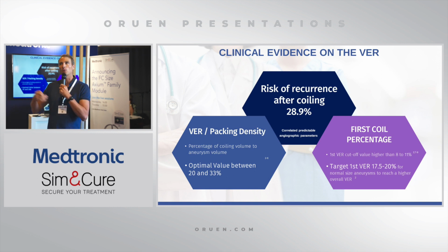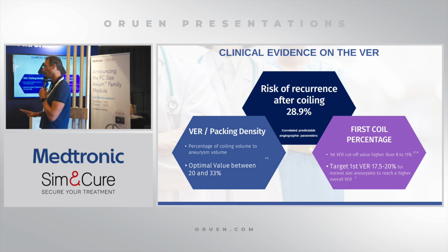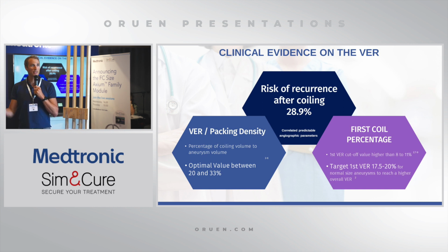And we just think, okay, just fill it. And when you think it's full and you cannot put in the last coil, then you stop. But this is not good, because the complication always occurs with the last coil. And if you do not put it in and there's no complication, this is a waste, like 500 euros in Europe, 1,000 euros in the US. Don't ask me why, but the waste is important. And I think in many angio suites in Europe and the US, people are hesitating to put in this last coil. This last coil may be a source of complication or maybe a source of waste.